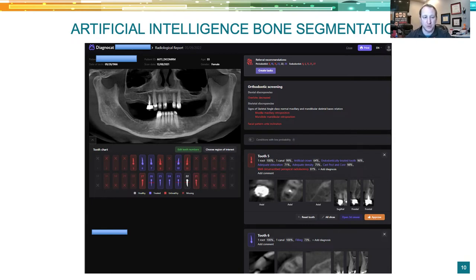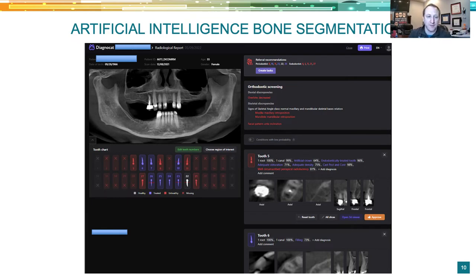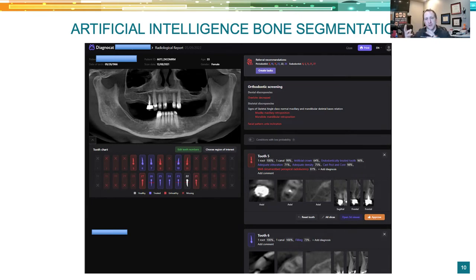Scrolling down, the report gives detail on each tooth. For example, tooth number five: it says one root with 100% confidence and one canal with 99% confidence. These are confidence ratings from the AI. It may show slices of each tooth with pathology, and you can approve or disagree with each finding. Once you go through each tooth or segment, it produces a nice PDF radiology report you can put in the patient's chart.